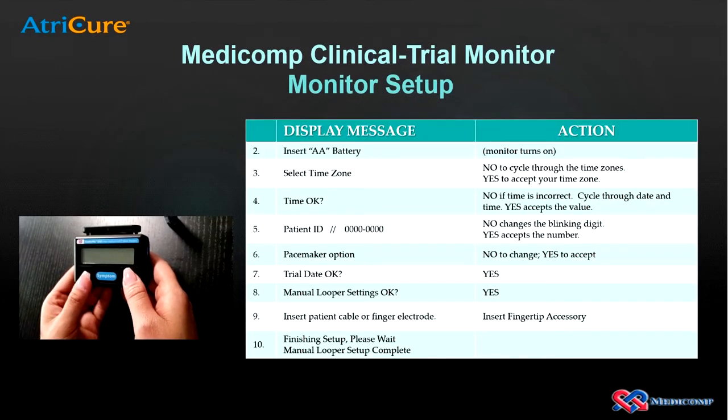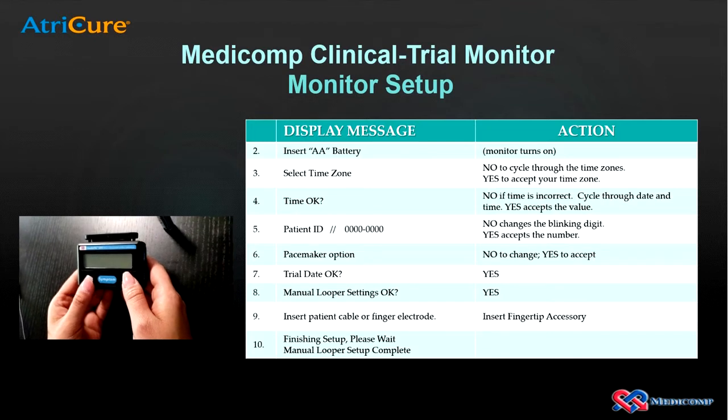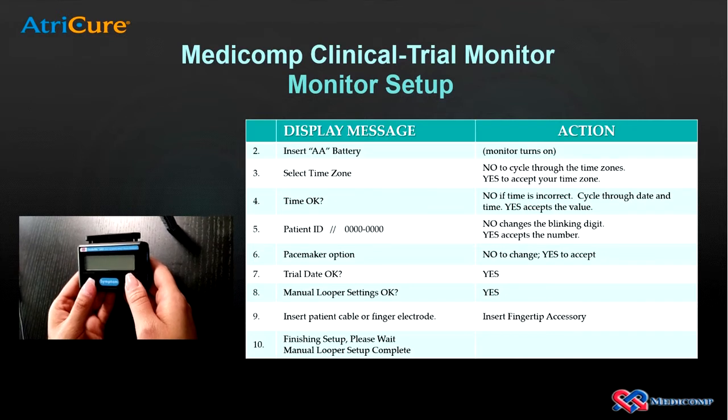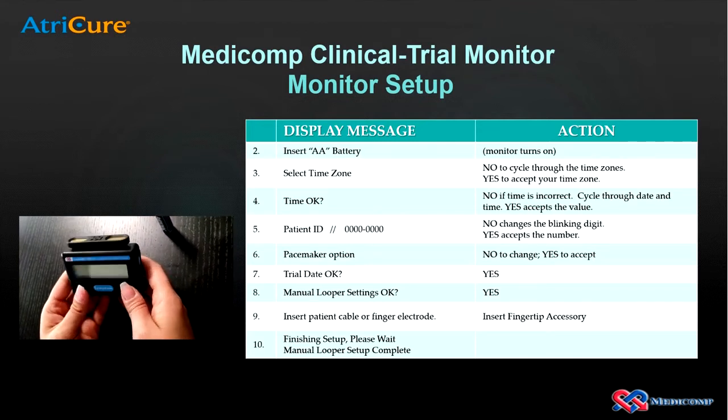Now we'll focus on configuring the monitor for a subject. Don't worry about any of the settings you change because we'll be erasing them at the end of this session. And by the way, if you get lost by pressing the buttons by mistake during any of these steps, just remove the battery, reinsert it, and start over again.